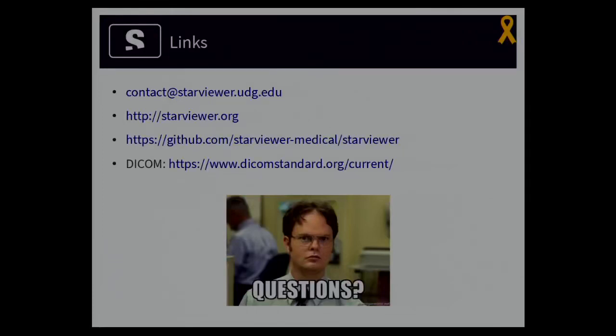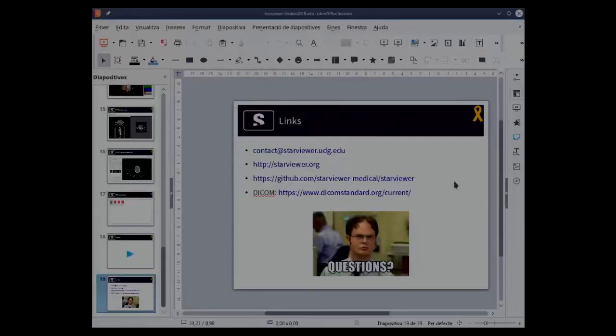This software is used in research, especially in main hospitals in Catalonia, in centers that do these CT scans, etc. They use it there, and these are the people that paid for the development of this software. Okay, thank you very much.